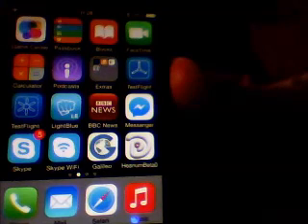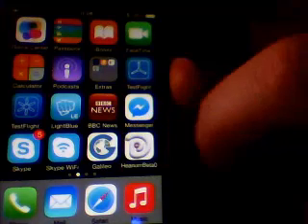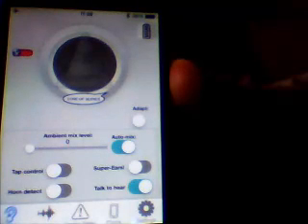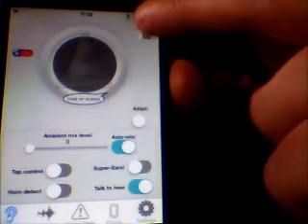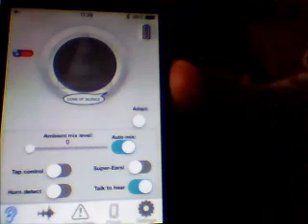Okay, so this is an overview of the Hearium app. I'm going to open it now. As you can see, it's connected to the earphone hardware device. Now I'm going to go through the functions of the buttons. This icon here displays a 5-state value of the hardware battery charge level. The icon is updated automatically when the app loads and can be further refreshed by pressing it.